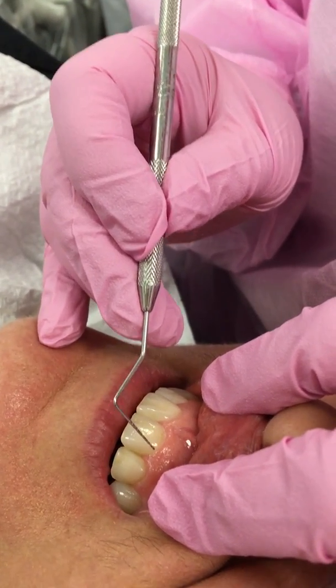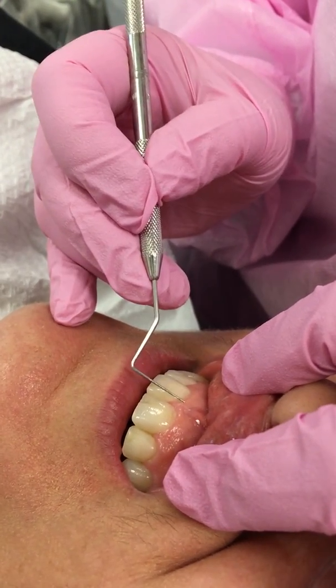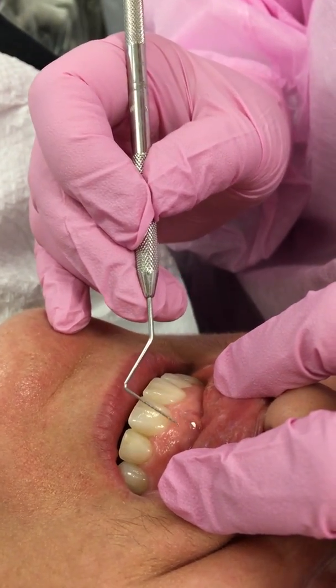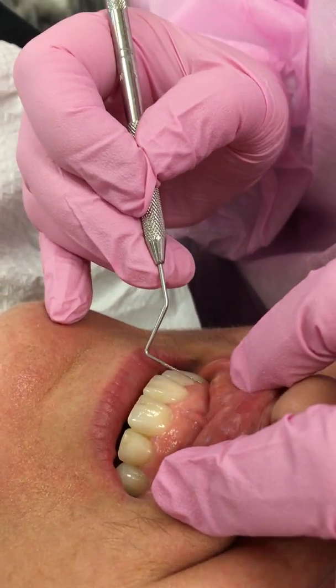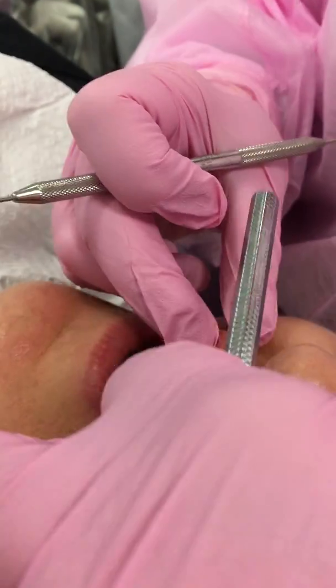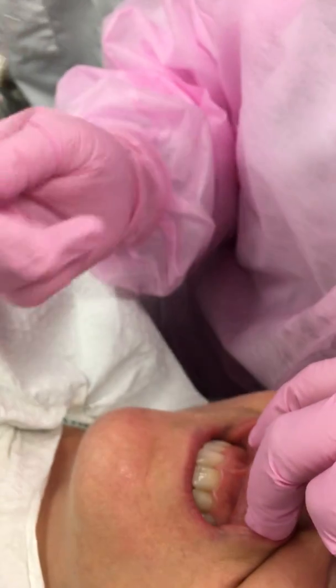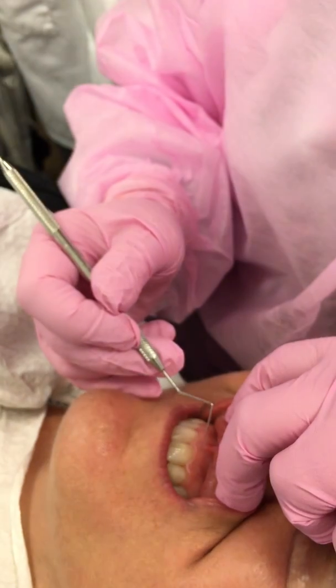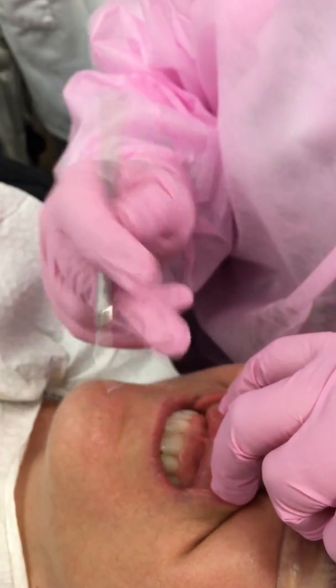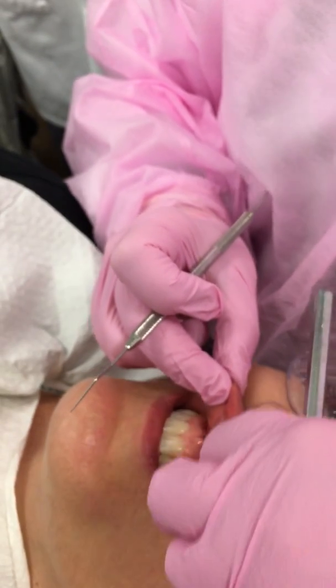Okay, so then we have that, and then do you see the nice pink stipple? See the orange peel? Okay, so that is the attached gingiva. And then if I pull this up, do you see a dark line of demarcation right there where it's a little bit more purple and it's movable?